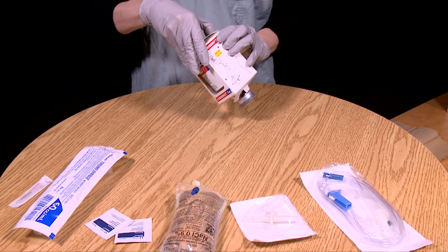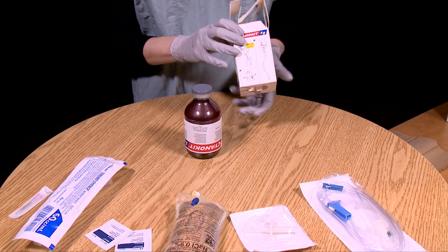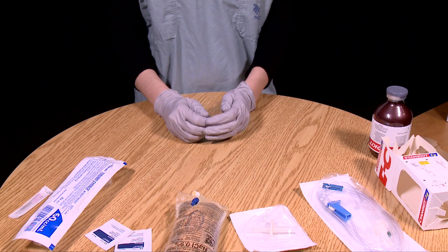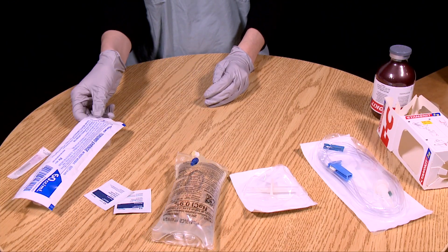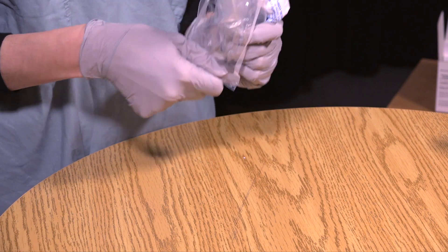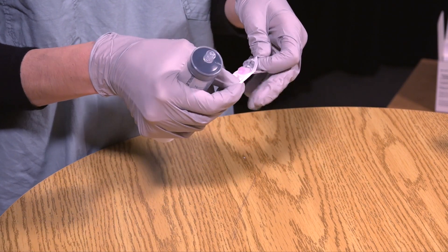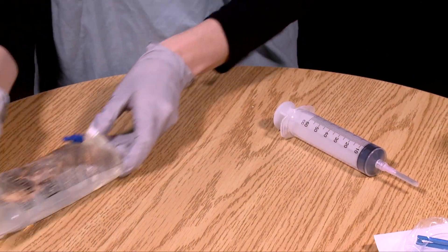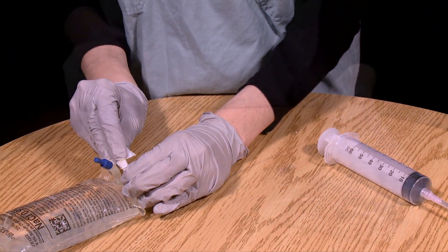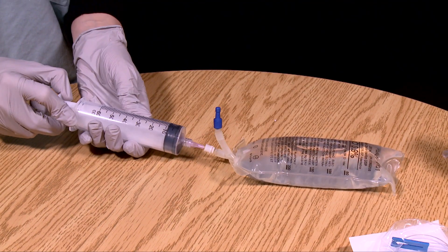Carefully remove the vial from the cardboard box — this allows easier manipulation during reconstitution. Set the box aside, as it will be used later to suspend the vial during administration. The five gram vial must be diluted with 200 milliliters of 0.9% sodium chloride. Take the 60 milliliter syringe and attach the needle. Take the 250 milliliter bag of normal saline, disinfect the medication port using an alcohol swab, then withdraw 50 milliliters from the bag.